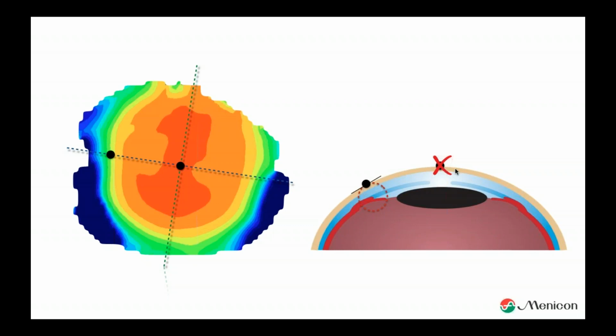It brings nothing in relation with the center part. It is only looking at where the tangent is. So what is the tangent of each point? And for your information, you think, oh, but the eye is curved. Yes, the eye is kind of curved, but every curve, let's say a circle, even a circle is built up and made up of straight lines. So let me explain that.